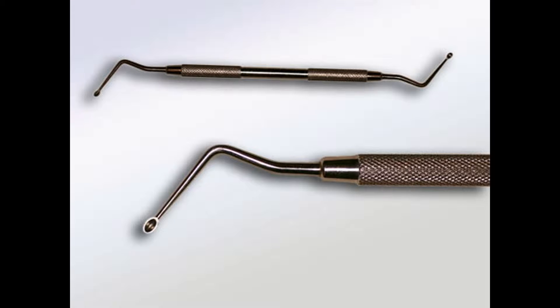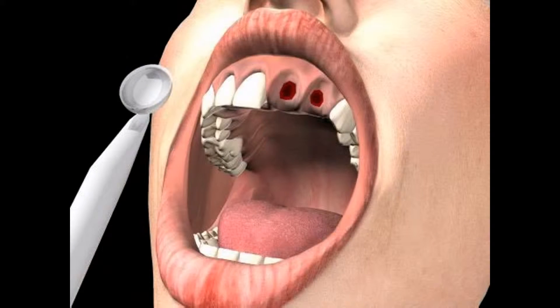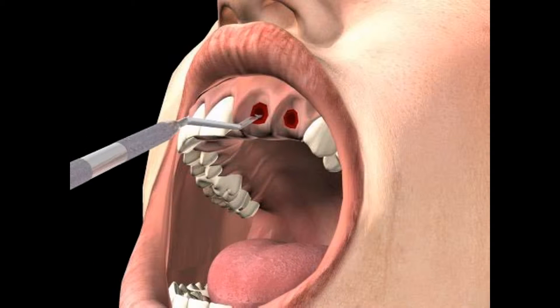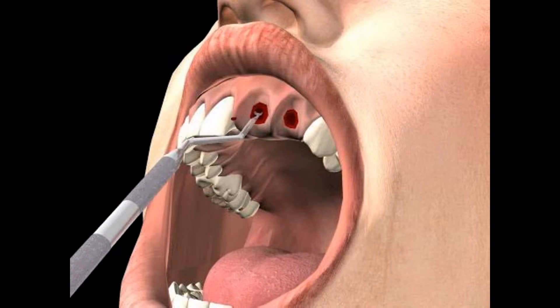In dentistry, the sharp spoon is used to remove connective and granulation tissue from the bone. In the film, you see how the sharp spoon is used to clean out the tooth socket, also known as the alveolus, immediately after tooth extraction.